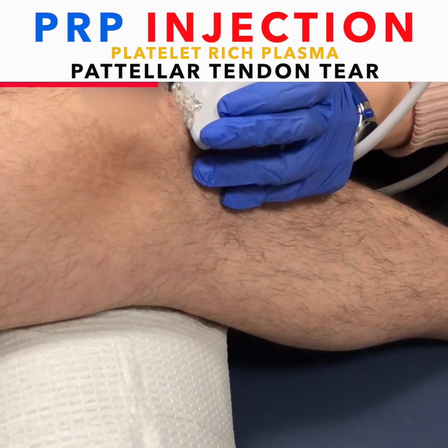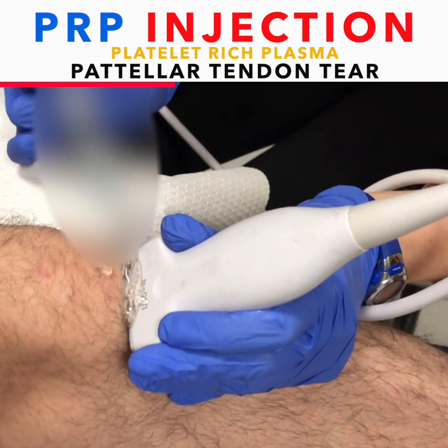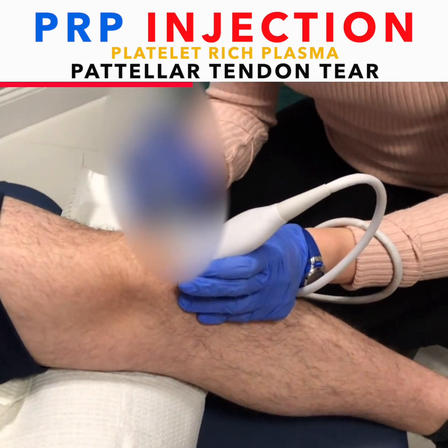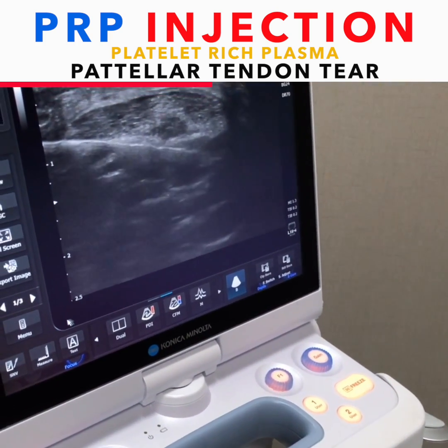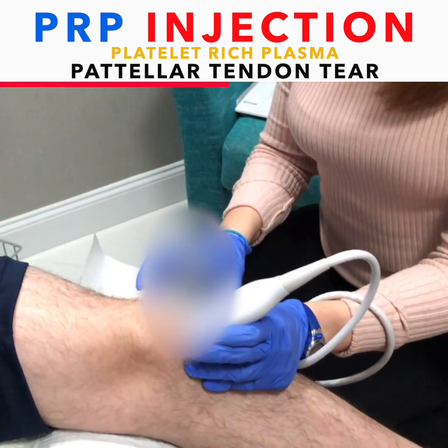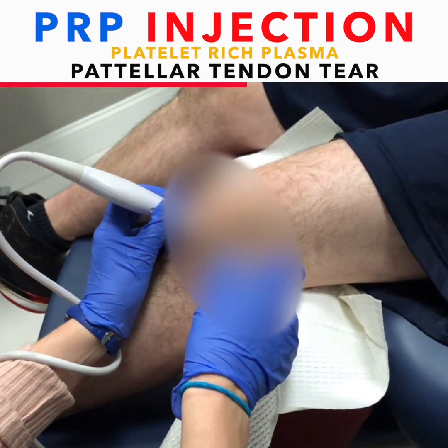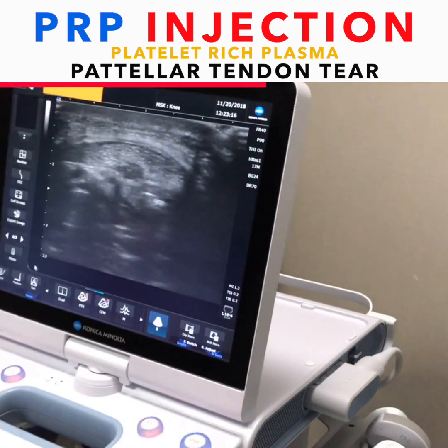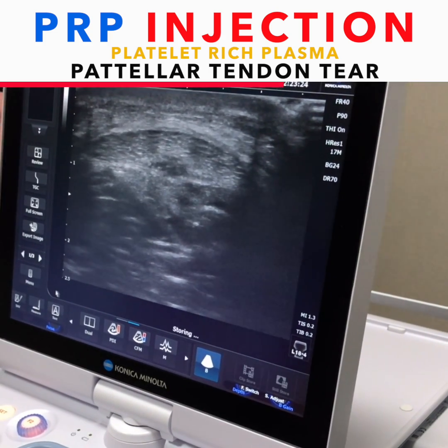It's very shallow. I'm just going to let it numb, just give it a moment. So let me take the PRP — just try to relax now. You're not going to feel anything. We are putting the PRP around the defect and into it.